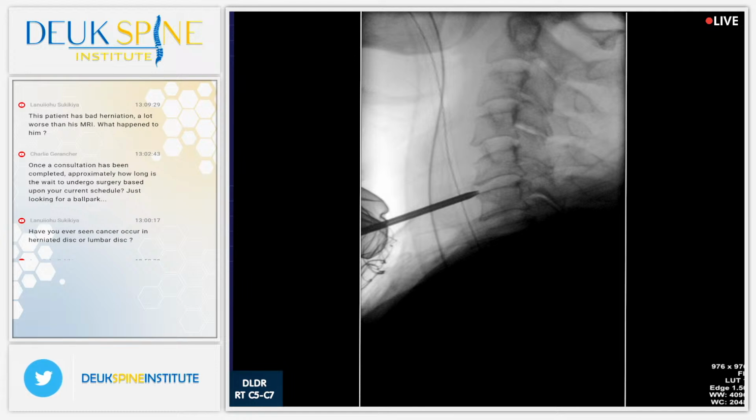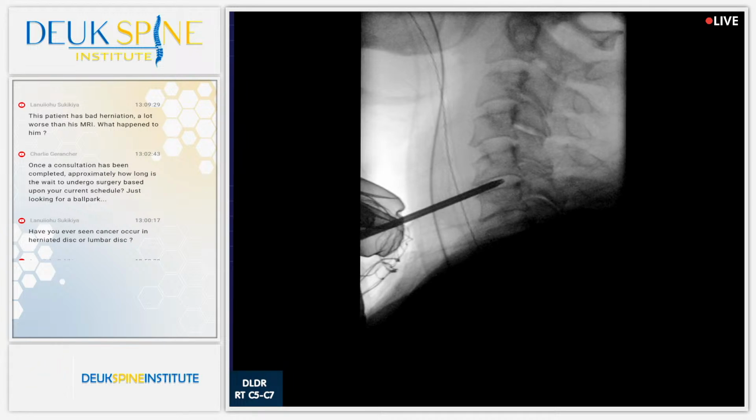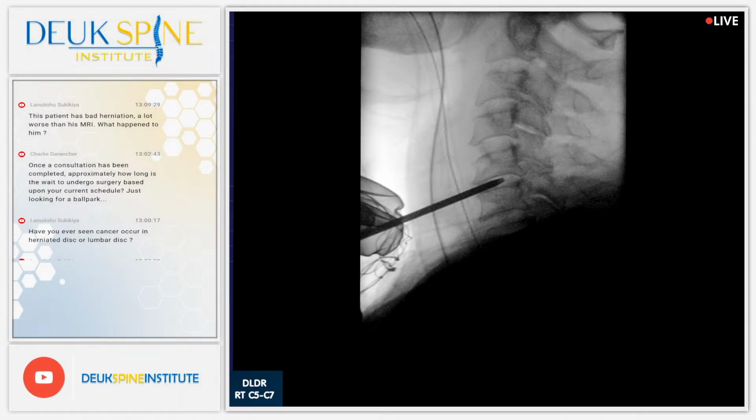Nope. Shot. All right, we are now inside number 5-6. We're going to do a discogram as we did before. Not easy. Shot. Shot.